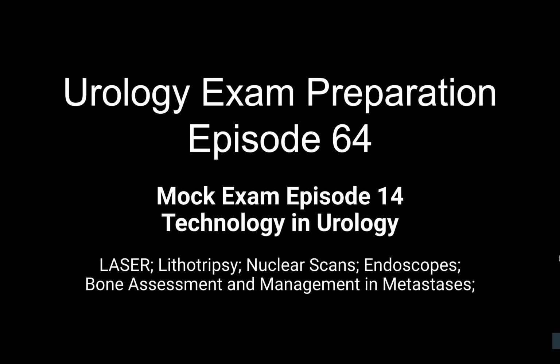Okay, so what is the advantage of the digital single-use ureterorenoscopes? So the advantage again is that they are high definition, based on the presence of a chip at the tip, which transmits a quality image to the monitor.